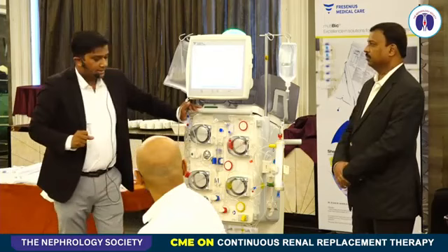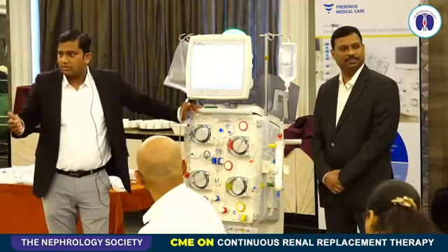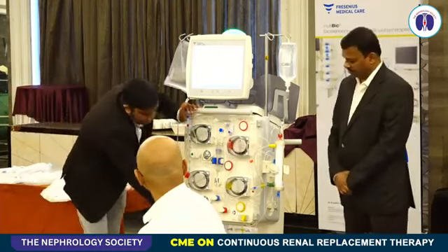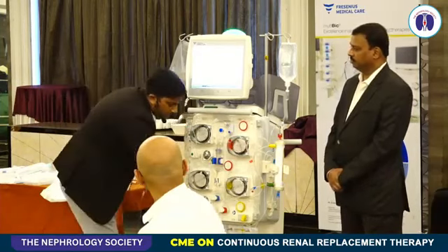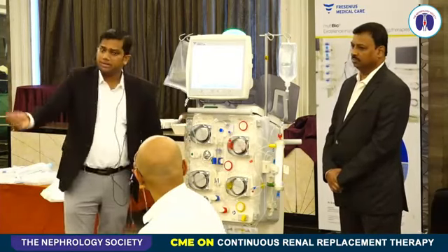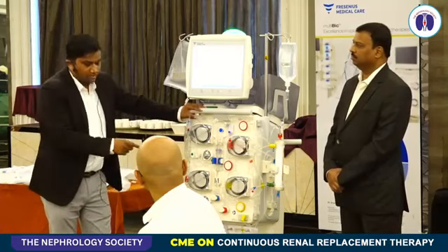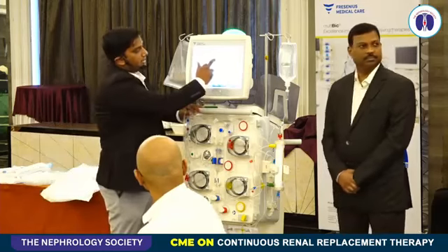Moving to the next, which is the most common mistake users or staff make. Let's say the bag strength is 10 kg and it is filled. They directly remove it and throw it away or empty the bag. It is to be done via the program only. You go into the menus and there will be an option.